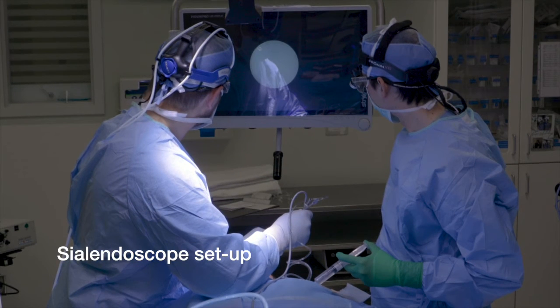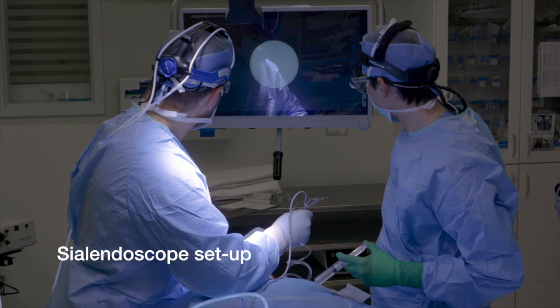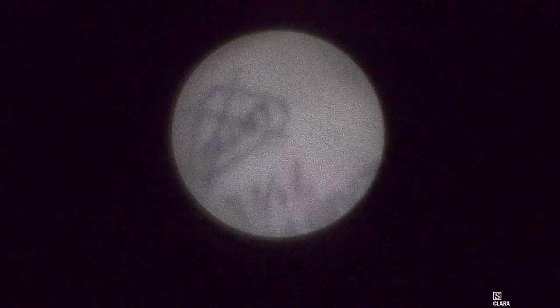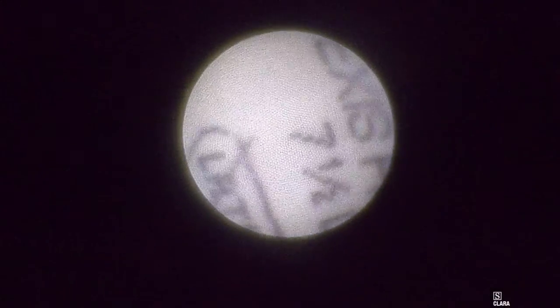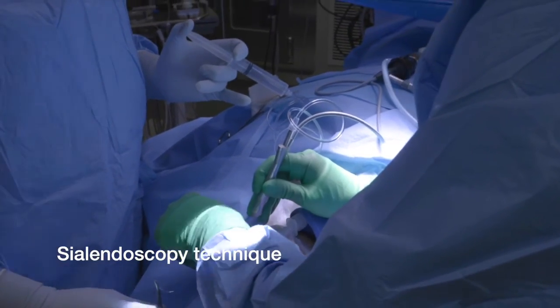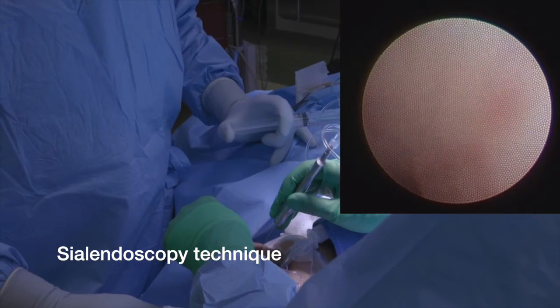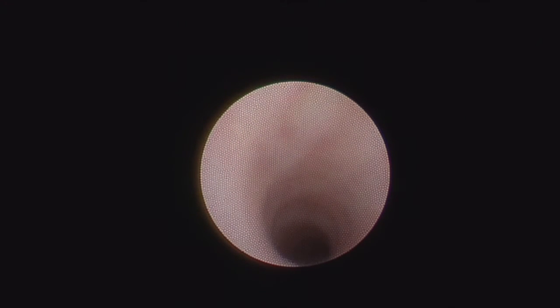Once the papilla is dilated, you are ready to use the sialendoscope. Here you see the setup, similar to a sinus case with the screen forward for visualization, and your assistant providing constant saline irrigation in order to open the duct and also irrigate out any debris within the duct. It is important to optimize your view of the sialendoscope — orient the sialendoscope as well as fine-tune the focus. I tend to do this using my glove and the lettering on the glove. You then introduce the sialendoscope into the papilla, and the key here is being able to visualize the lumen and keep the lumen in the center. The non-dominant hand is often providing a lot of the traction, and changing the counter-traction will change the view with the sialendoscope, making the dominant hand holding the scope in some ways even less important than the counter-traction provided with the non-dominant hand on the cheek in the case of a parotid, or in the floor of mouth in the case of a submandibular sialendoscopy.